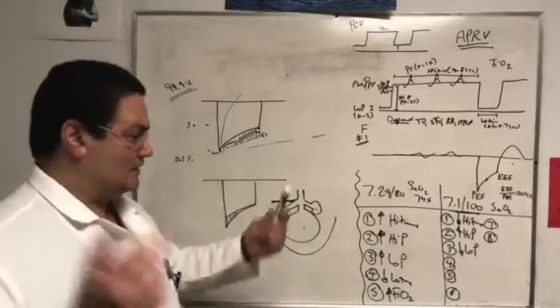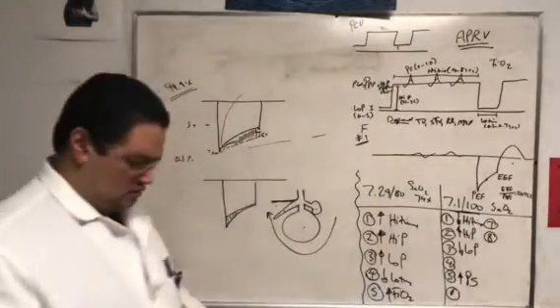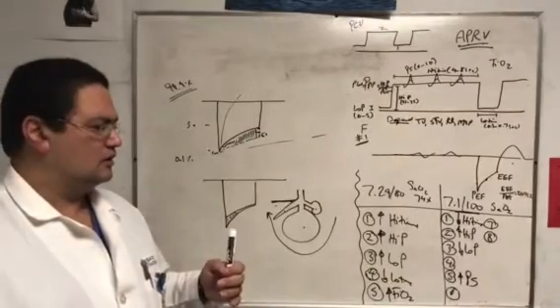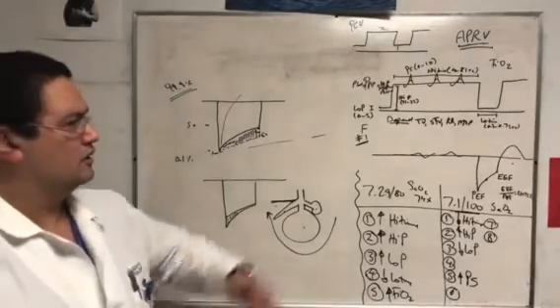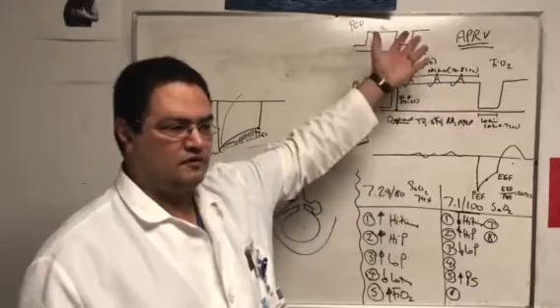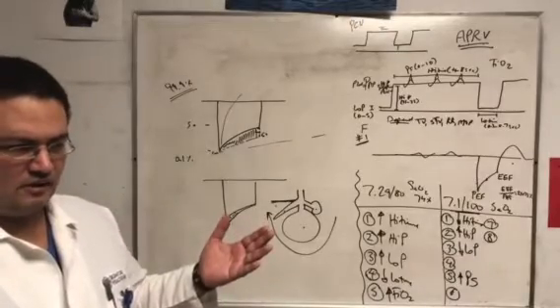Pressure support. Yes. So we'll increase the pressure support. That's number 5. This is all in order of preference, right? So increase the pressure support. Why? Increasing the pressure support is guaranteed to actually increase your minute ventilation by definition, right? You have a small tidal volume here, 150 or something. You add tidal volume, it becomes 250 each. That's it. You increase your minute ventilation, guaranteed. But why is it number 5? It's not higher than that.